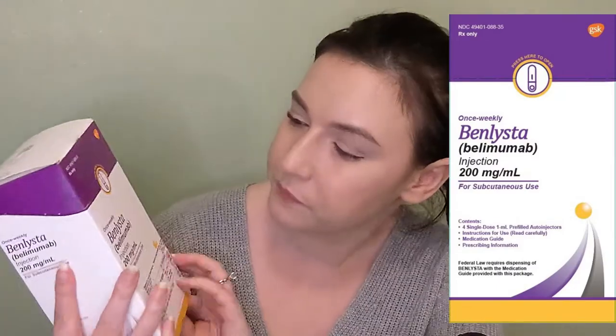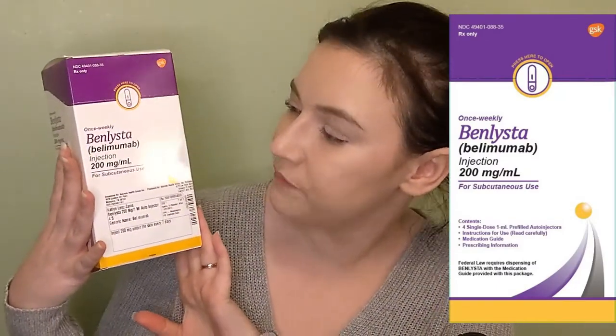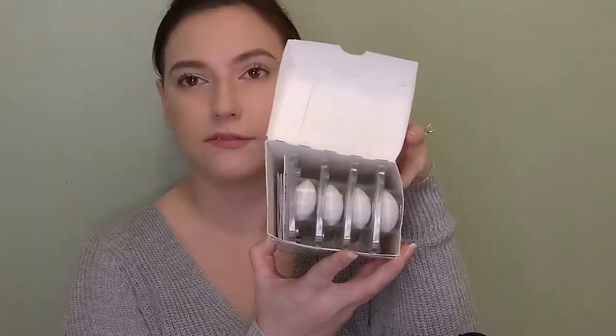So let's go over what's in here. It says 'Once Weekly Benlysta.' The generic name is belimumab — I probably shouldn't have tried saying that. This is an injection for subcutaneous use. It has a picture of the actual size of one of the auto-injector pens, and on the back it has information about how to properly store it and details about the manufacturer and manufacturing process.